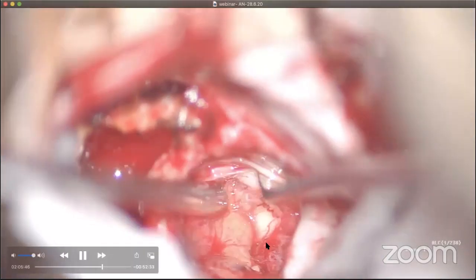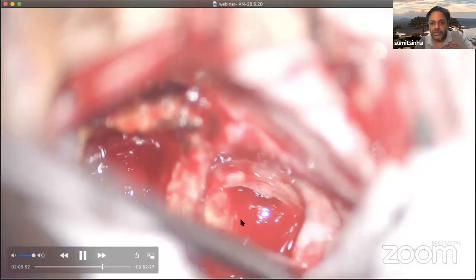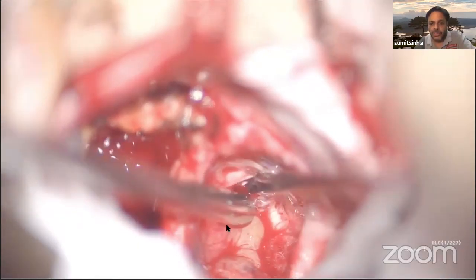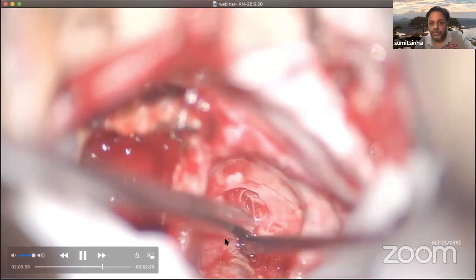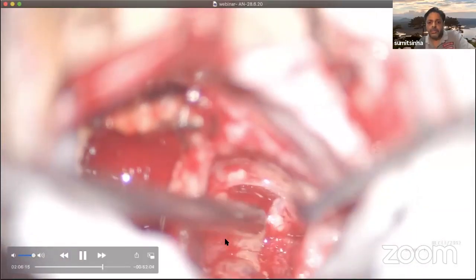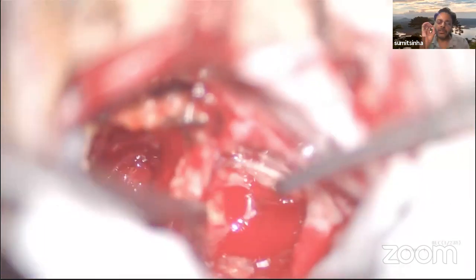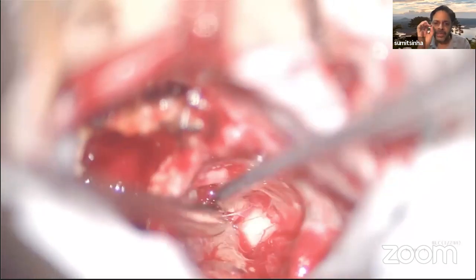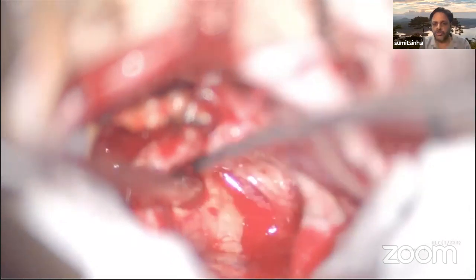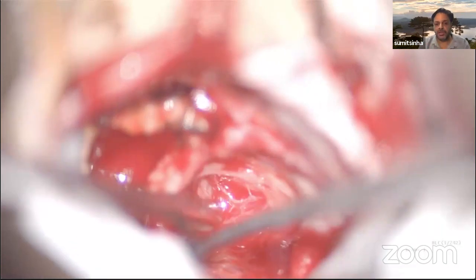This is the facial nerve over there. See, this is a shiny silvery white structure, and this is the joy of an acoustic neuroma surgeon to see the facial nerve during the dissection, as you might all agree with me. So this is the triggered EMG response again. And you have to use your EMG again and again, not only to identify but to check the integrity of the facial nerve. Something which you don't want your neurophysiologist to comment on during the surgery is the train of EMG impulses coming from the facial nerve.